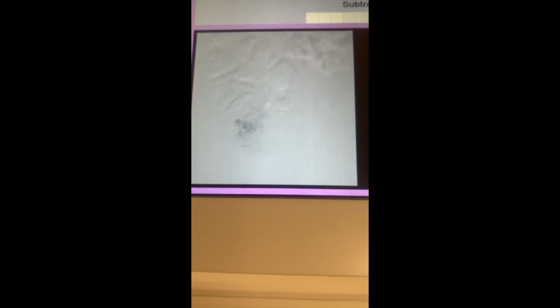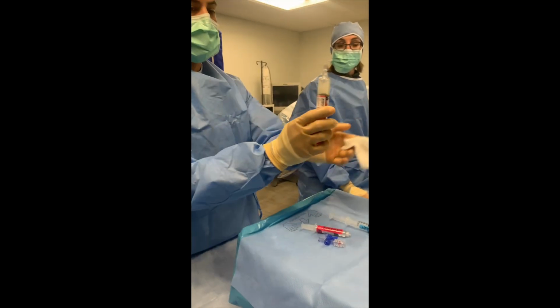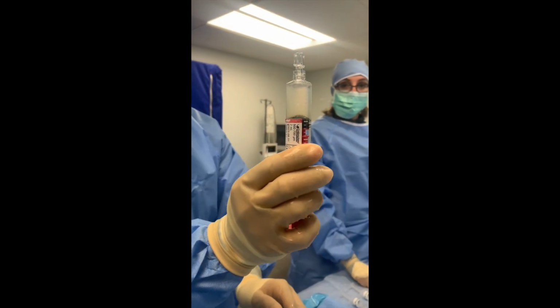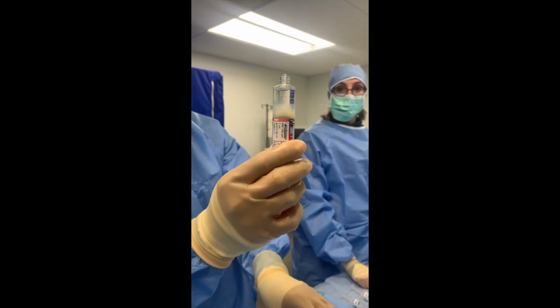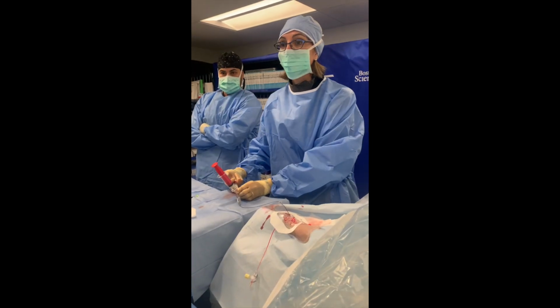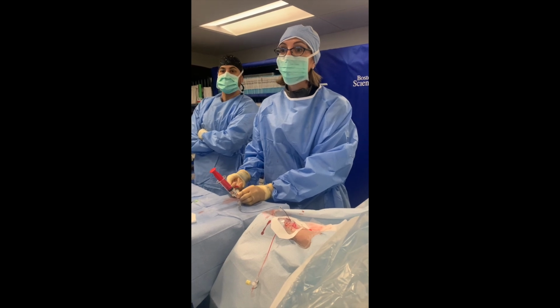That's just beautiful. Okay, we'll take 5 to 7. Make sure bubbles are all out. Wait for it to settle a bit. Oh, little embolic. A moment of UAE. You see it on the screen? Let's see on the screen.